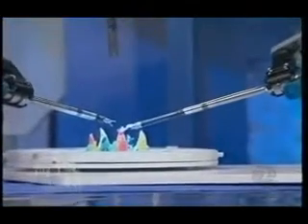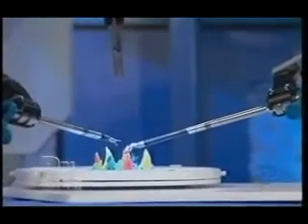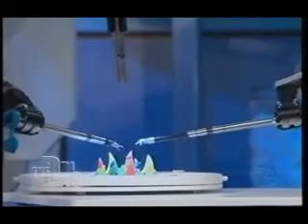It's robot-assisted laparoscopy. You still need everything out here, you've got to have your brains. But it just makes more difficult surgeries so much easier. Wow. Look at that. You just put your fingers in these little loops, and you're totally in touch with the robot. You feel like these are your hands.